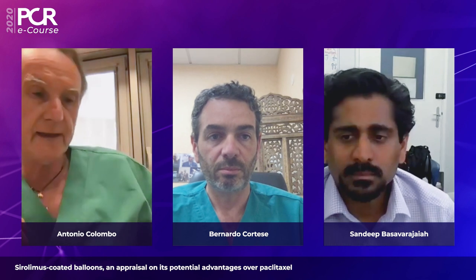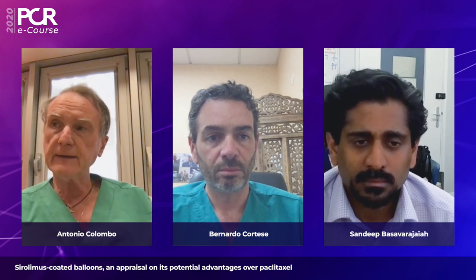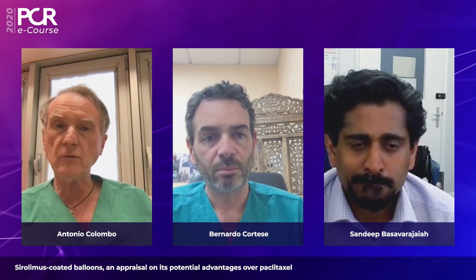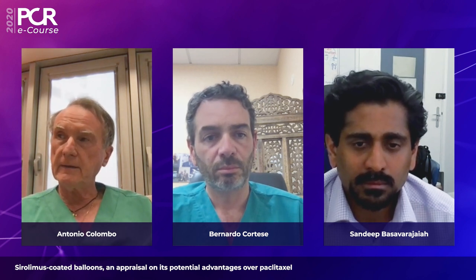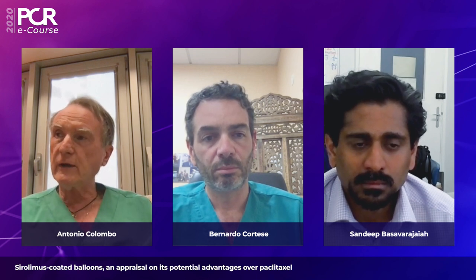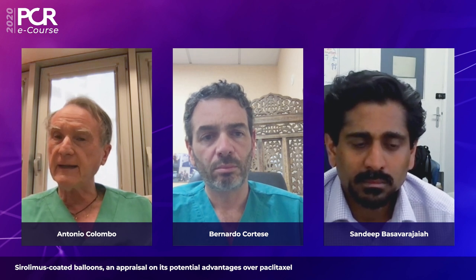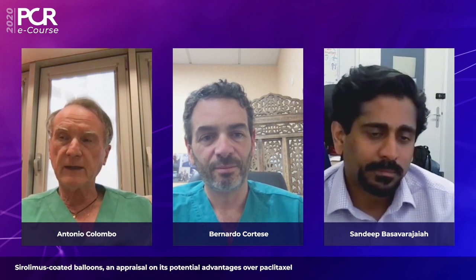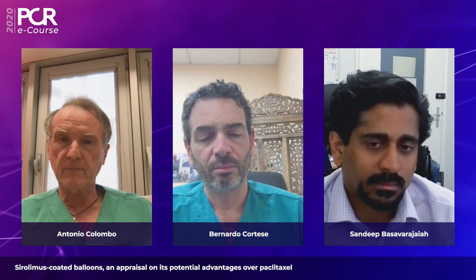Bernardo, I totally agree with you that the delivery of this balloon is very easy. It comes in between a semi-compliant balloon and the best DES. On a scale of 1 to 10, if you give 10 to the semi-compliant balloon, I will give this balloon 8 for deliverability, and the best drug-eluting stent 7. So it is superior to the best drug-eluting stent and slightly inferior to the best semi-compliant balloon.